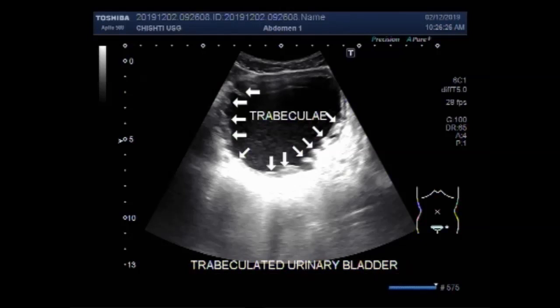This is the trabeculated urinary bladder. This is the urinary bladder.